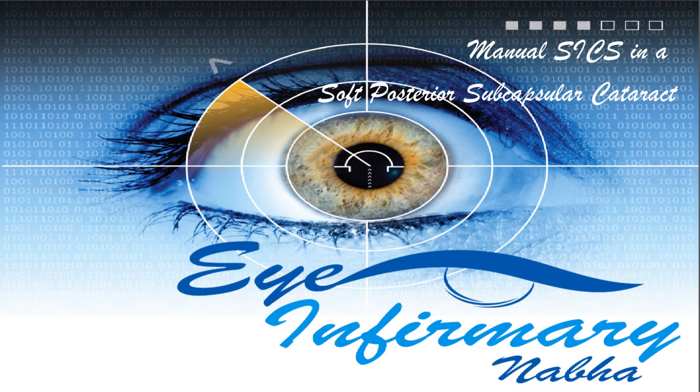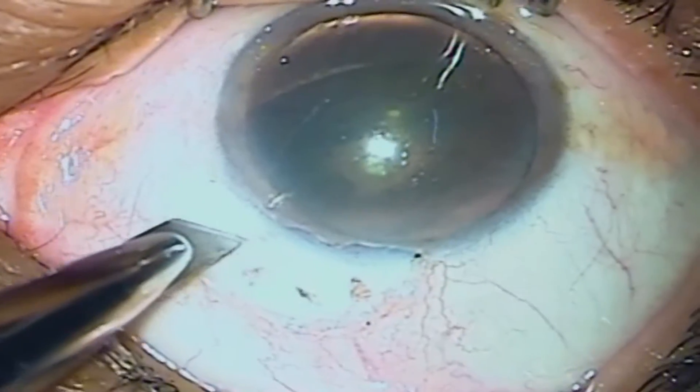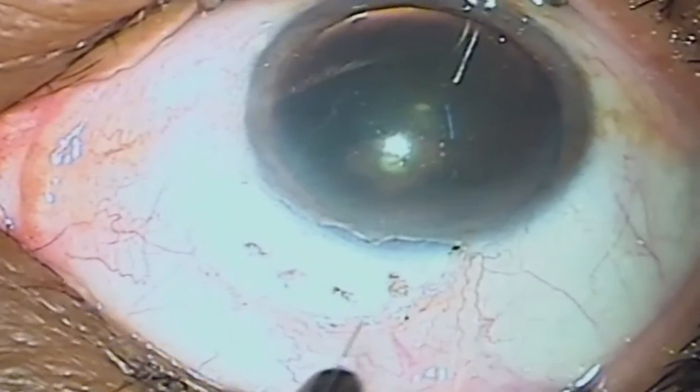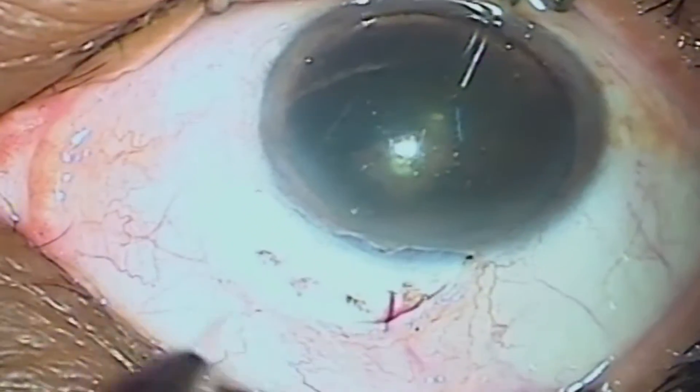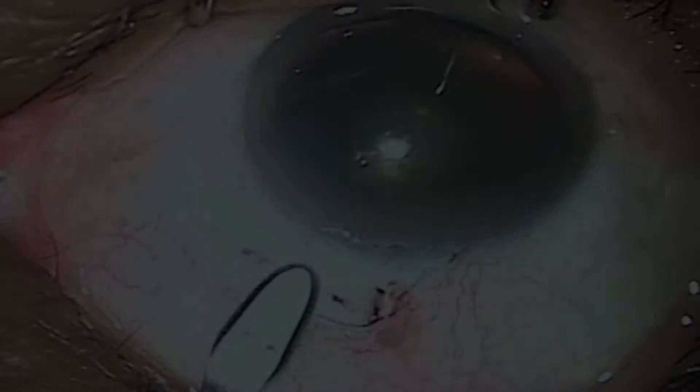Greetings from my infirmary. We will be presenting this case of soft posterior subcapsular cataract in a young diabetic patient, being taken up for supronasal manual SICS. The surgery was taken up with our routine steps and protocols as explained in previous videos.